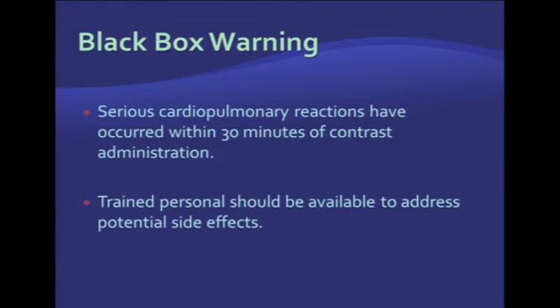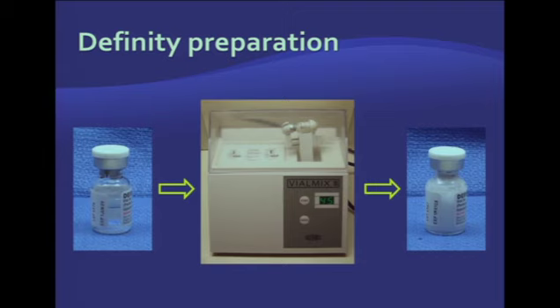As you may know, there is a black box warning issued by the FDA on all contrast agents, and it has been significantly decreased in recent years. The current black box obligates you to tell the patient that serious cardiopulmonary and allergic reactions have been reported within 30 minutes of contrast administration, and also obligates you to have trained personnel available to address potential side effects.